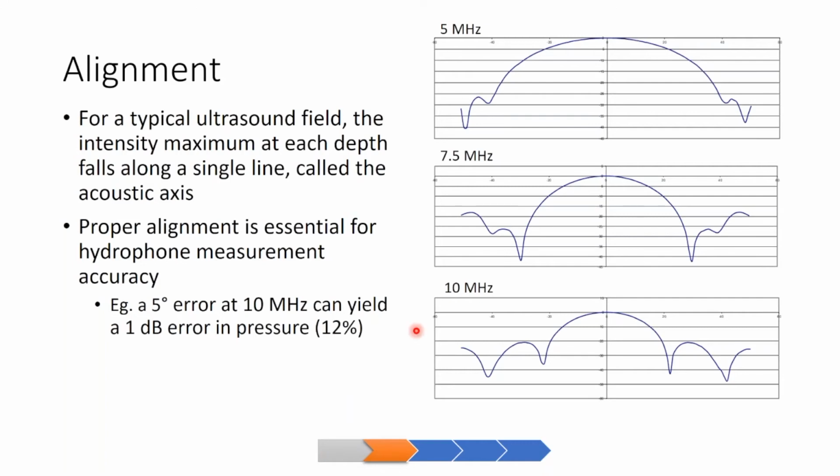So shown on the right here is a frequency response. So I have an intensity here as well as an angle left and right of, in this case, minus 40 degrees, and this is positive 40 degrees. And as we rotate the angle of the hydrophone relative to the source, the sensitivity changes quite a lot.